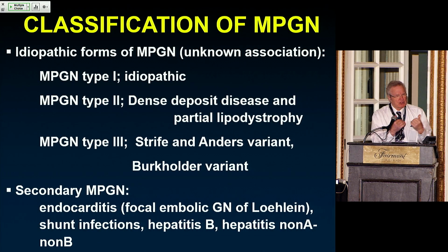When the disease persists in time, you move from a purely inflammatory reaction in the glomerulus to repair. And the repair involves the formation of a second basement membrane with double contours. Then we talk about the membranoproliferative pattern of injury. The term membranoproliferative glomerulonephritis should be banned.